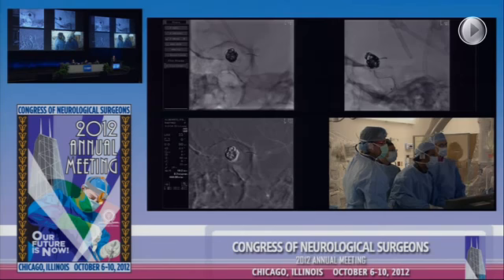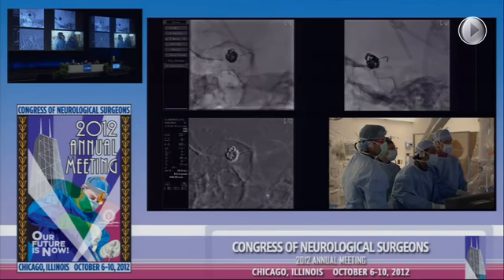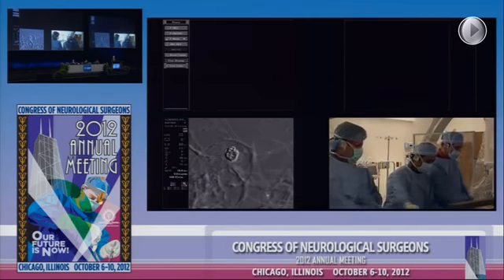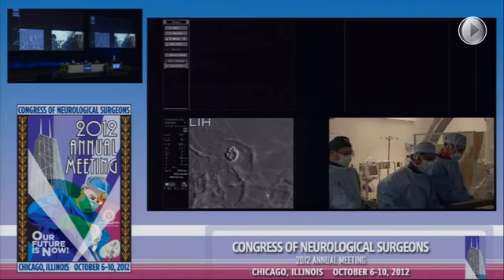He's coming back through the stent to ensure that it's patent, if it's easy. And he's wired back into the MCA in case there's another one he wants to put in, which will be very unlikely, given that there's a coil mass already.